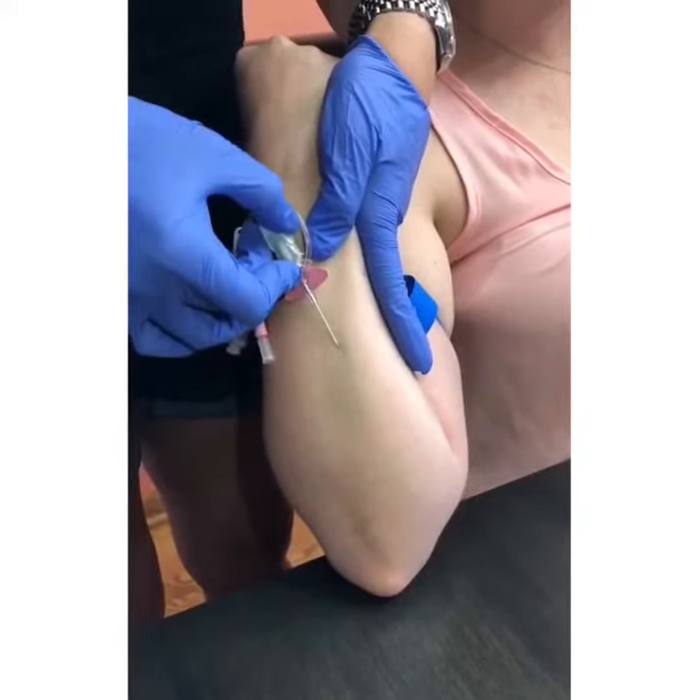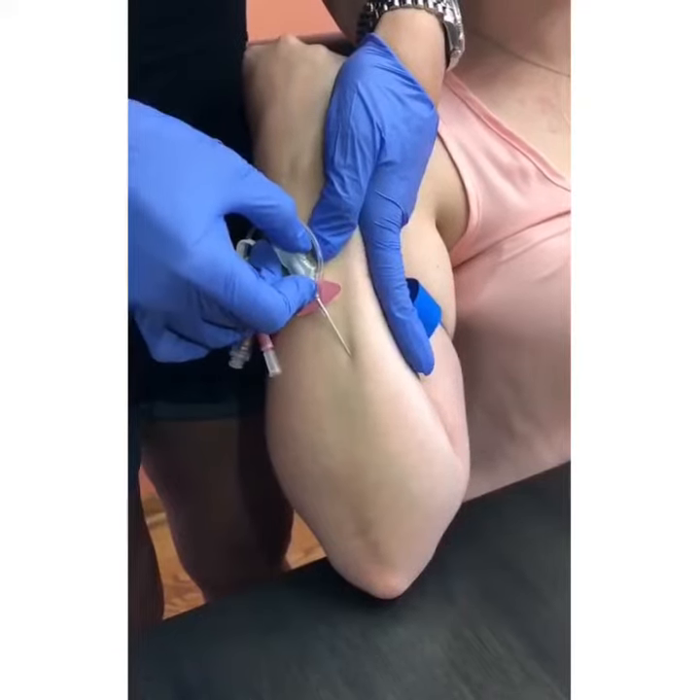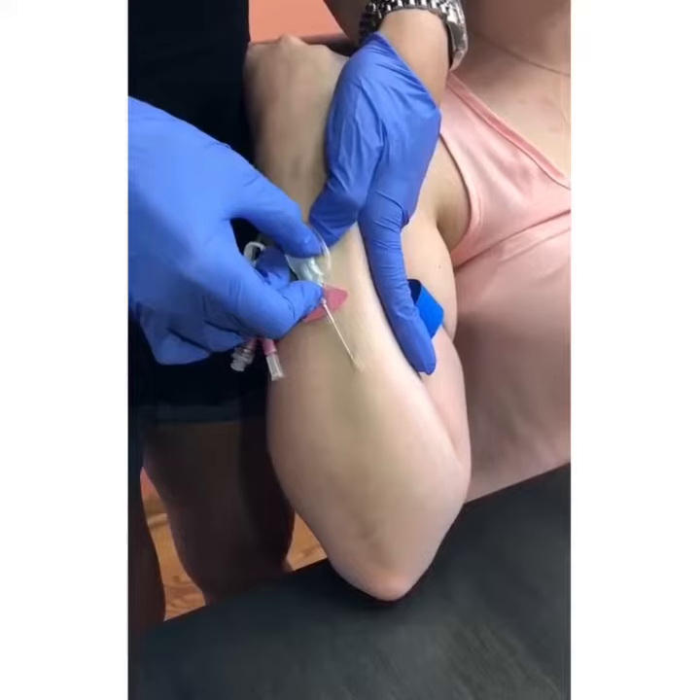If you're afraid of popping the vein, I suggest initially inserting the needle under the skin, then gliding it toward and into the vein.